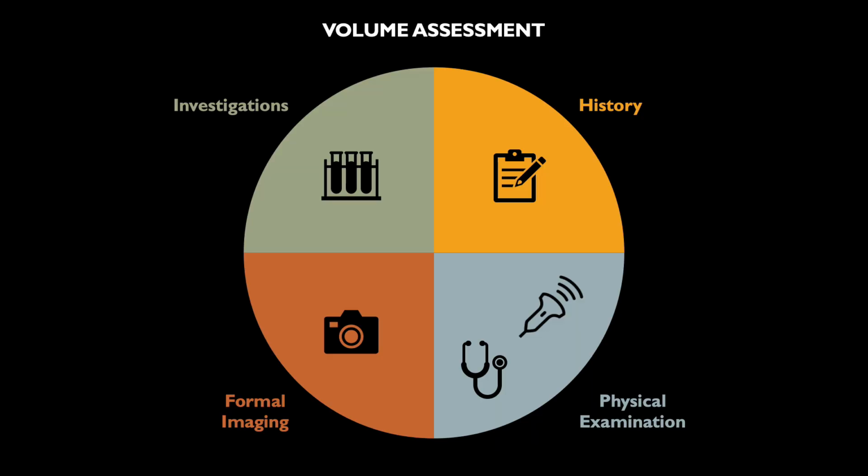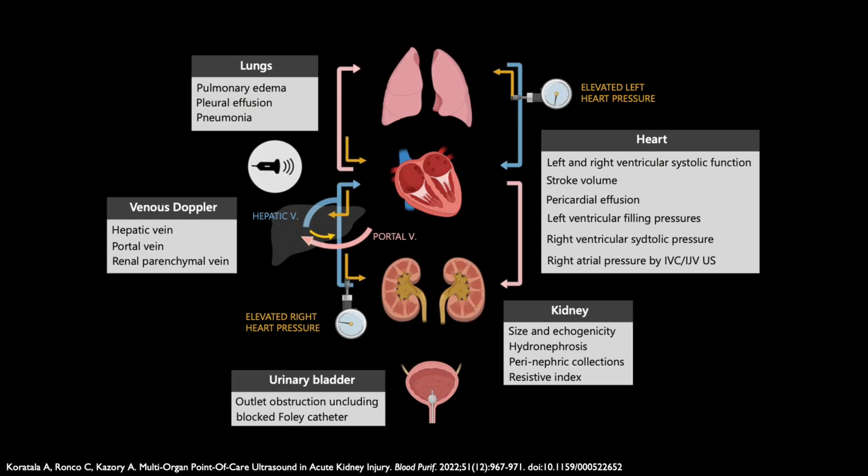To round out this talk, here's one of the first slides we looked at, and while this talk focused on bedside ultrasound, this is a reminder to approach volume status as a holistic clinical assessment. This is a final look at the diagram we referred to initially. Throughout the 3 cases, we've used many of the strategies referred to here to assess our patient's hemodynamics through multi-organ ultrasound. This is a reminder as to how many parameters can be assessed in patients with training in the visualization and interpretation of POCUS imaging.